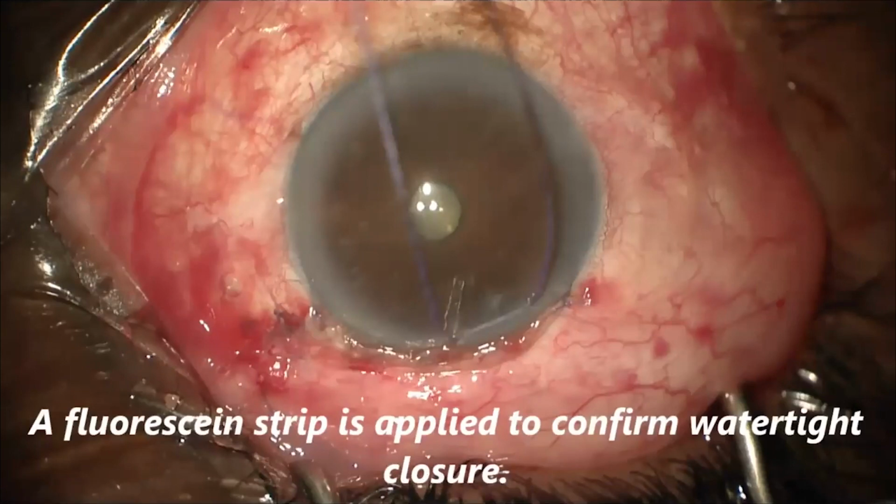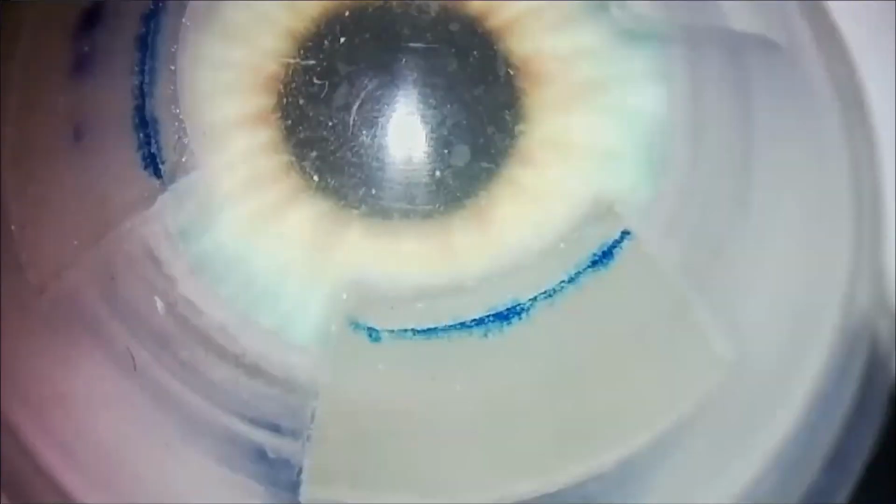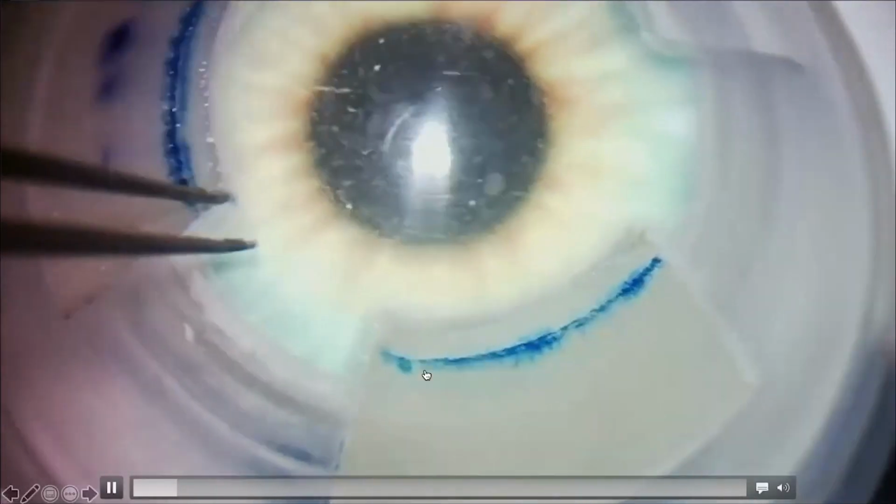So again, we're trying to get a more controlled bleb forming procedure. And again, I kind of consider this a little bit of a hybrid between doing a tube and a trab for me. So where does the simulation kind of help? This is one of the simulators.